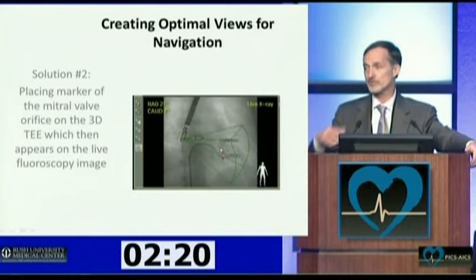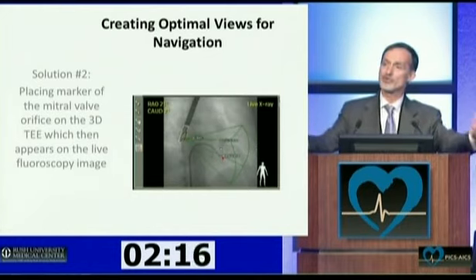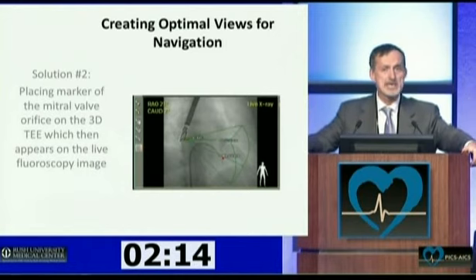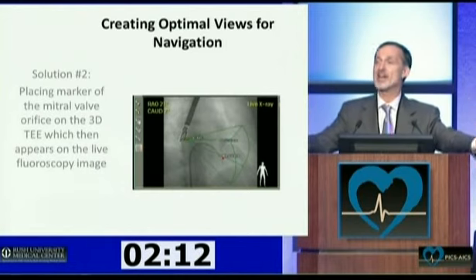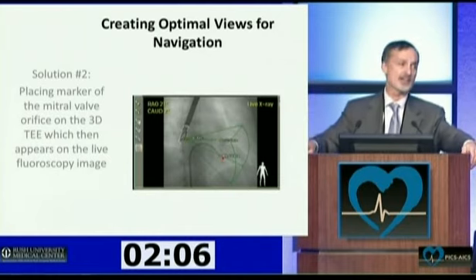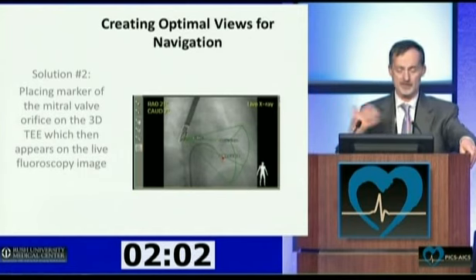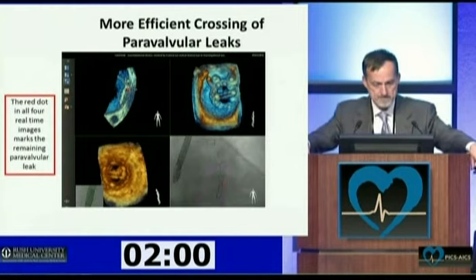These are labels. Very important when we're talking about, as John did, hybrid rooms where you've got a lot of people in the room and half the people know what you're doing and half the people don't know what the heck you're looking at, what you're seeing. And you can put labels on it and show them and keep everyone on board, and that really helps the whole team stay on board.